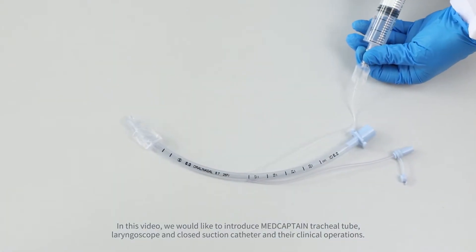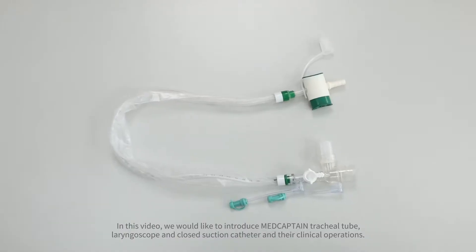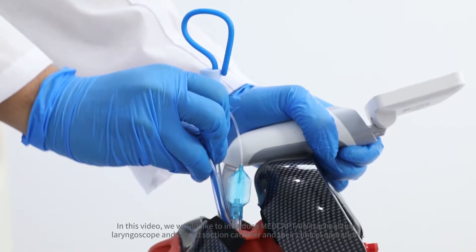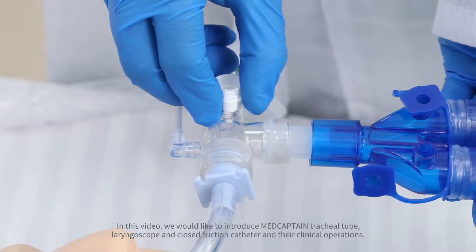In this video, we would like to introduce the MedCaptain Tracheal Tube, Laryngoscope, and Close Suction Catheter, and their clinical operations.